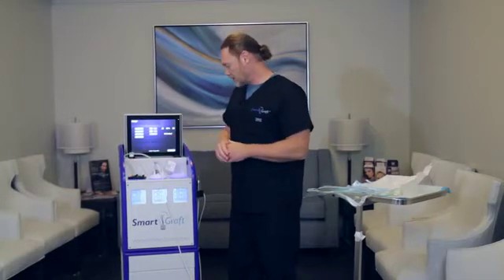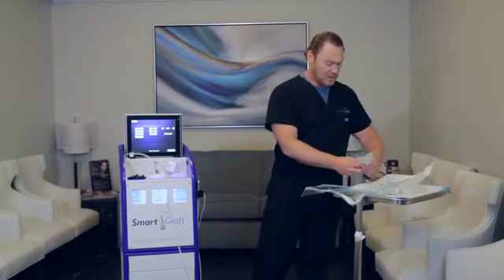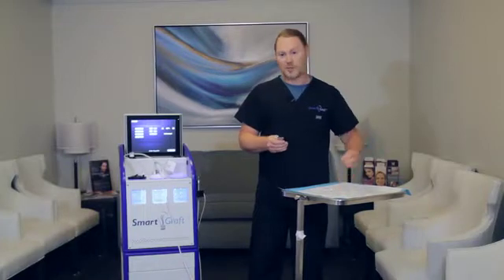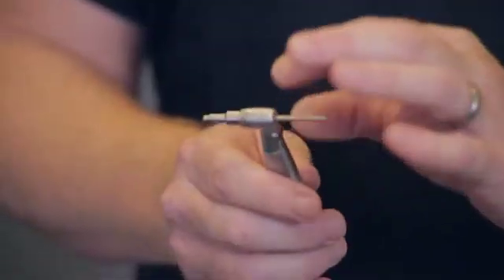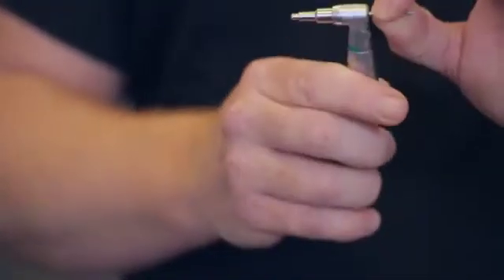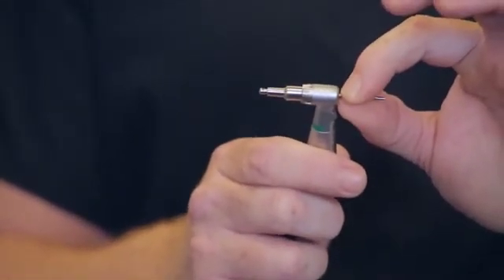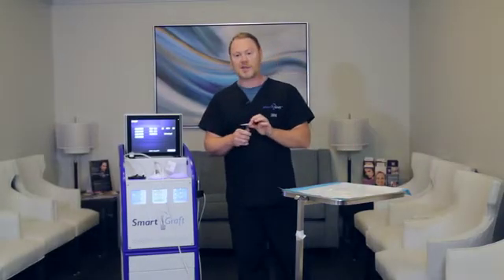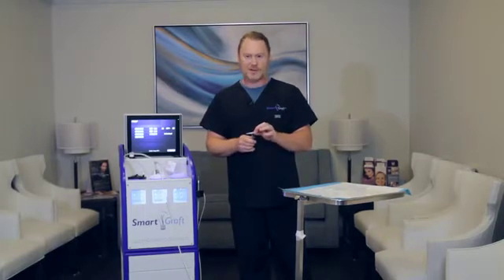That's the basic graft canister setup. Now we have to do the handpiece itself. This is the handpiece that connects to the motor. First, I like to put in the punch. It does have a little locking mechanism, so the easiest way to do this is just to set in the non-cutting edge and do a light little tiny twist and it locks right in. It cannot come out — that's how you test it to make sure that it's in there securely. If you don't have this in securely, you'll lose a little bit of suction.